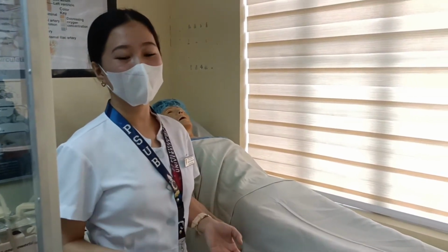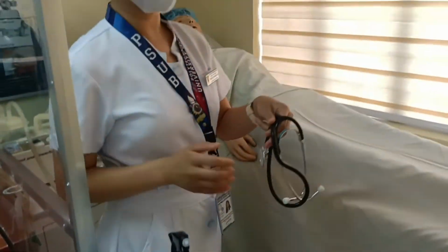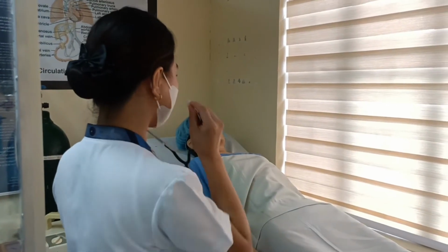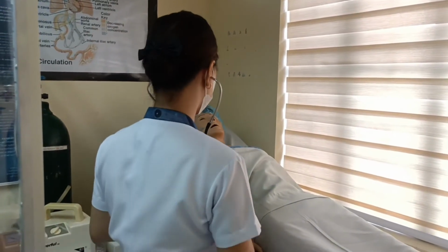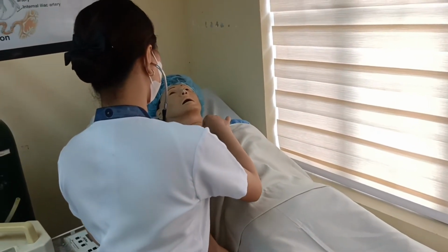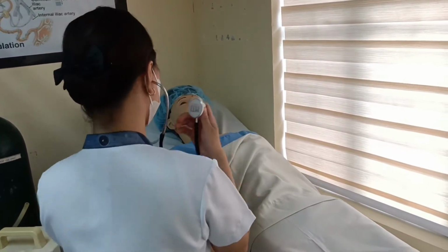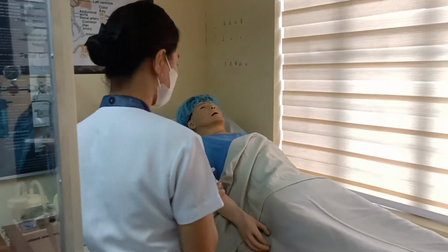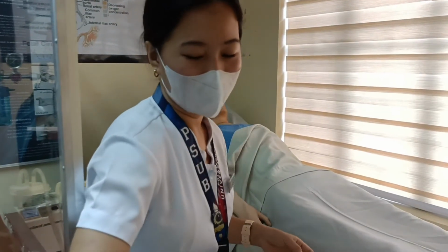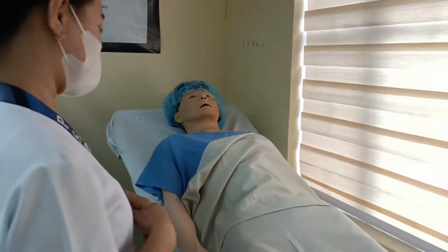Next, we need to assess for the suctioning. So we are going to auscultate for the gurgling respiration, restlessness, and vomitus in the mouth. Then next, we are going to assess the patency of the nares. Check natin yung ilong kung gaano kalaki, kaliit, at kung may nakabara.